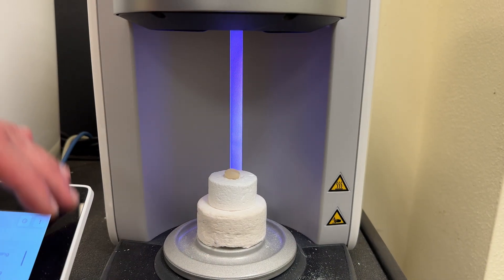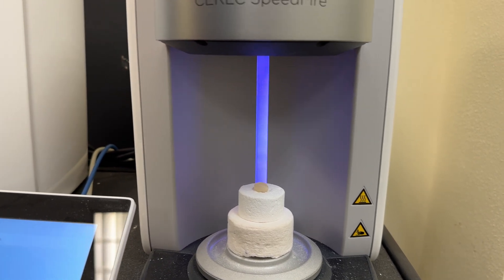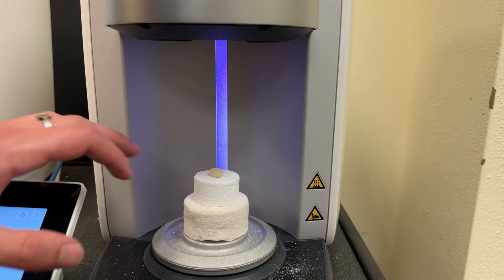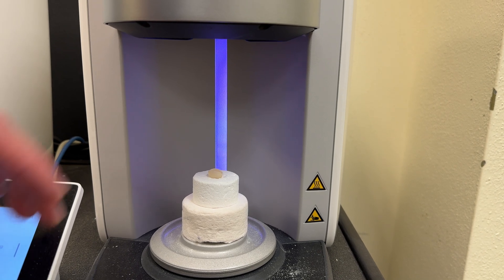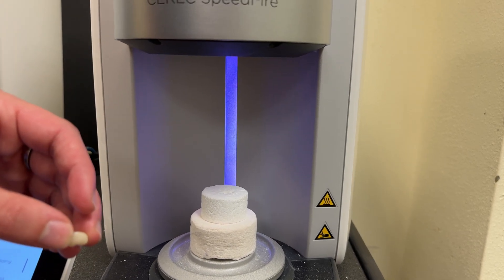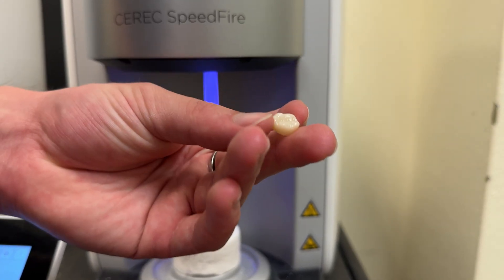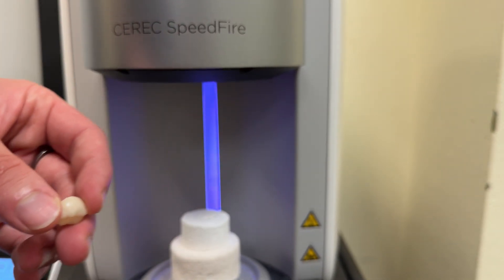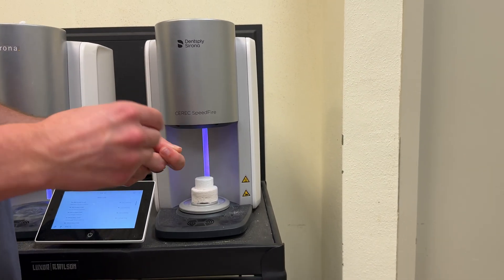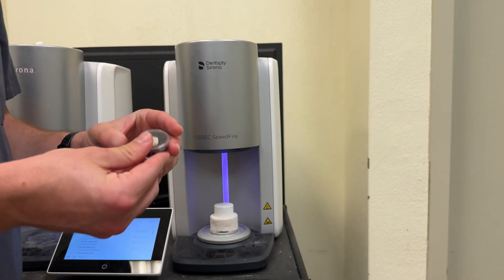Now that our crown has finished sintering, we can make sure it's safe to grab. The temperature right here is about 102 degrees Celsius — that's the temperature inside the actual firing unit, not the temperature of the crown itself. It dissipates heat when outside really well, so we're safe to go ahead and grab it. If you're ever concerned, you can use tweezers. This is what it looks like once it's done — it looks phenomenal. We're going to grab one of these small carrying cases, open it up, place our crown inside, and then we are ready to take this to our appointment and deliver it to our patient.